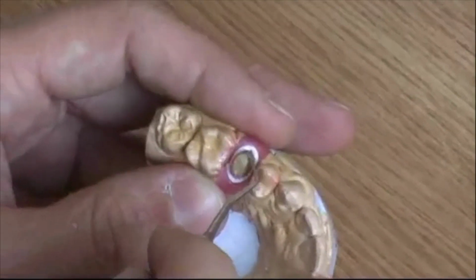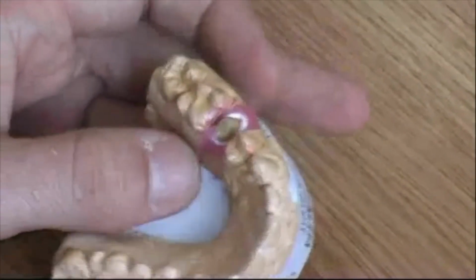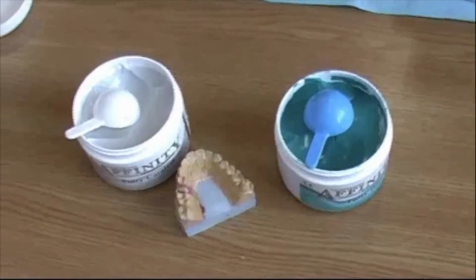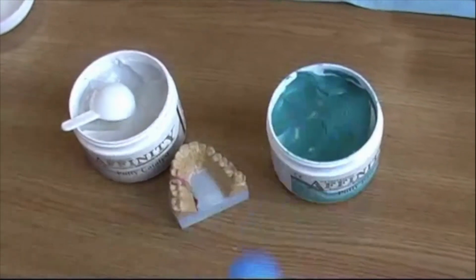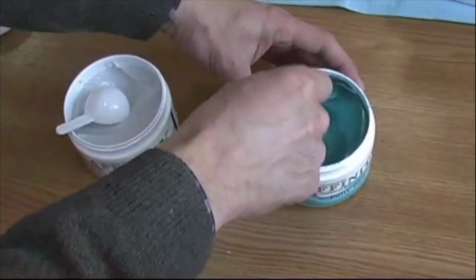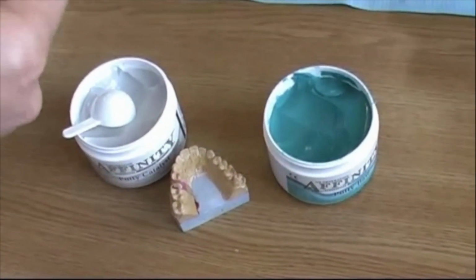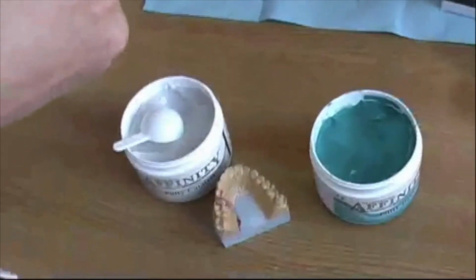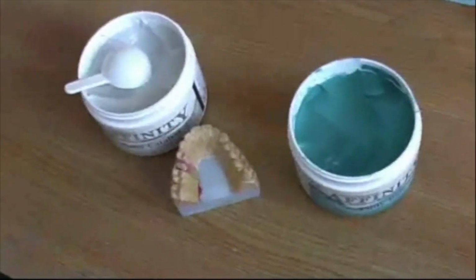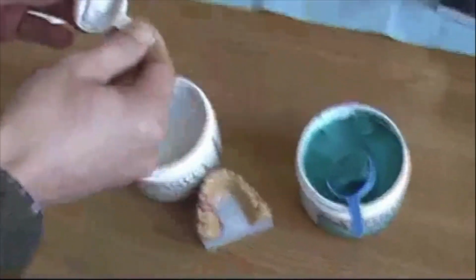So that's our preparation for the step 1 of the impression, which is the putty. It has to be nice, dry. And now we take the impression. This is a putty material, addition silicone. How do I know? Because it's 1-to-1. There's one amount, one quantity of base, as you see it. Base is always the color. And the equal amount, it doesn't matter how much, but it has to be equal. An equal amount of catalyst, which is always white.